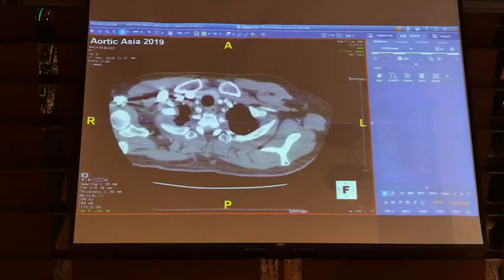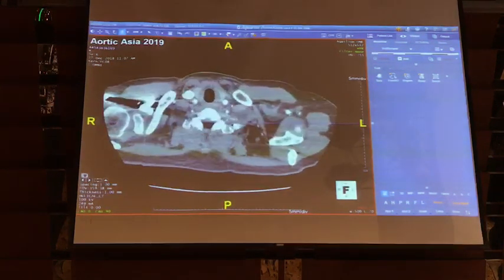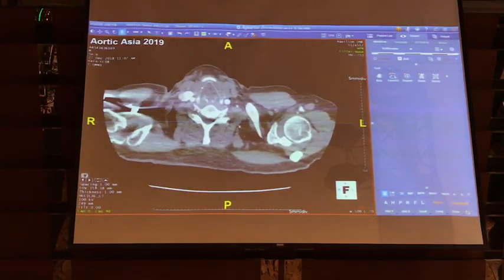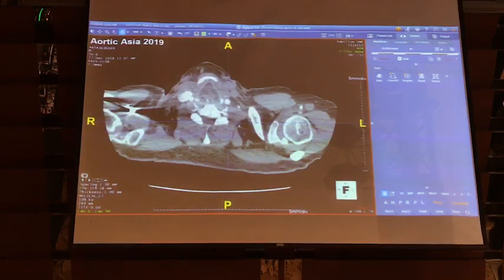or just said no fenestrations. I think there's a lot of tortuosity there, so the graft will twist around a lot as you introduce it. It may be a bit too aggressive to go all the way landing in the center, I suppose. We still have this alignment problem, even if you do an arch branch, so the hole would be bigger. Correct. So given all of those issues, that might be the way. The most traditional is a standard tube graft and do bilateral bypass or something like that. Would anybody like chimneys?